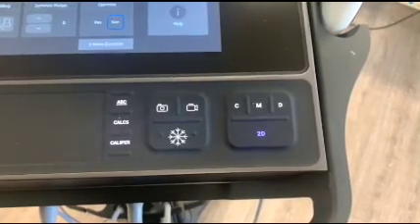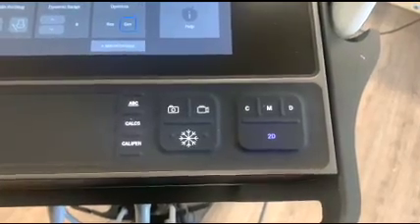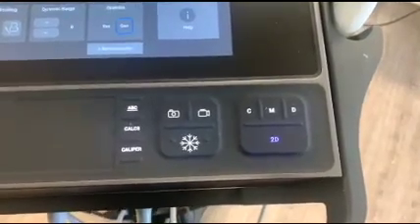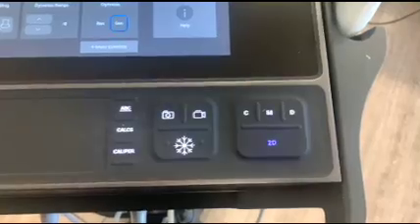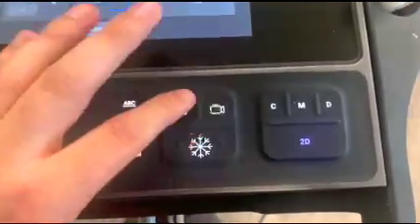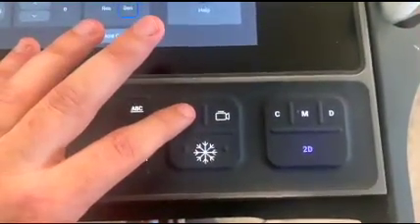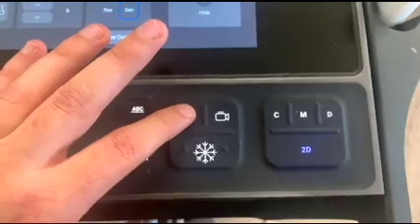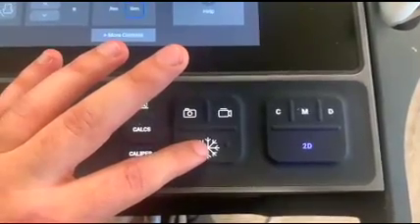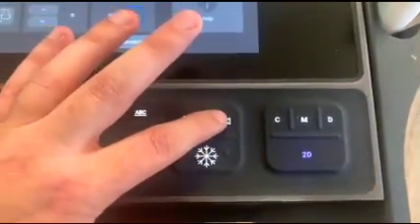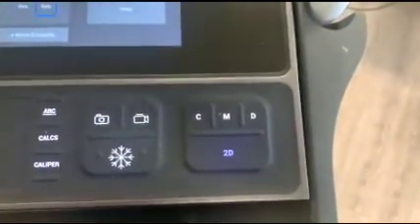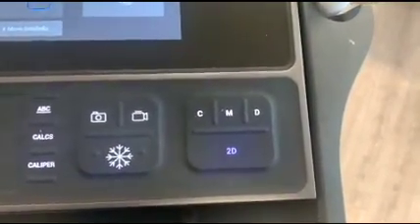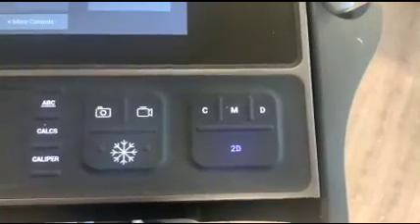This machine has all the same functions of a standard ultrasound, and those things can be found here on the bottom right corner. If you'd like to take a picture, click here. If you'd like to freeze the image, click the snowflake. If you'd like to take a video, press here.